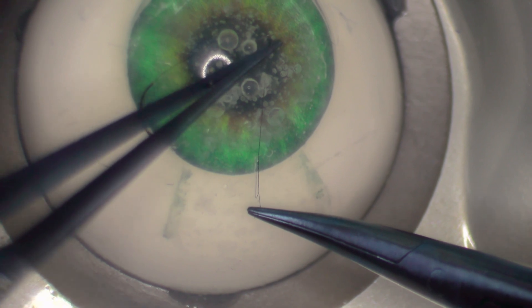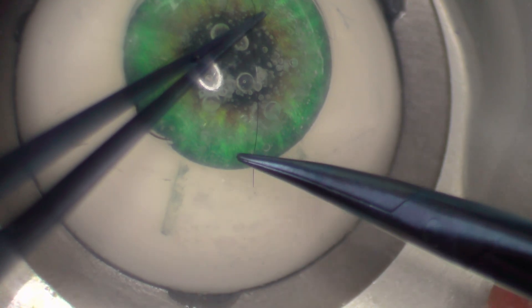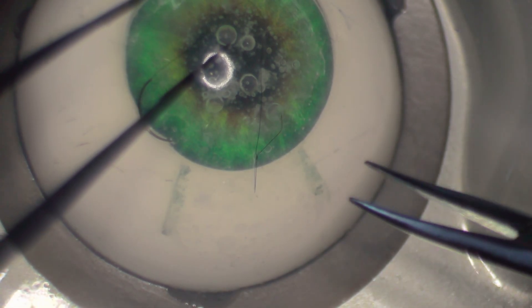Here's how to cinch it. First, pull both ends in the opposite direction. Then keep tension on both ends while you move the short end over to the long end. Let me show you this with a piece of string — imagine this is your triple throw. Tighten it down, and then to cinch it, keep tension on both ends and bring one of them over to the other side while keeping the tension on and pulling it over in an arch. You keep tension on both ends, pull one side over, and it stays.